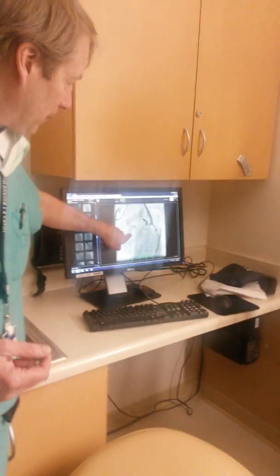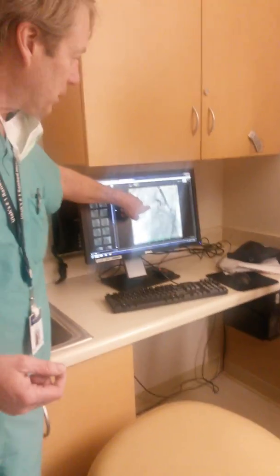Where that metal ring is relative to some of the other stuff — in this view it looked to me like the best view to figure out where we need to put that stent.